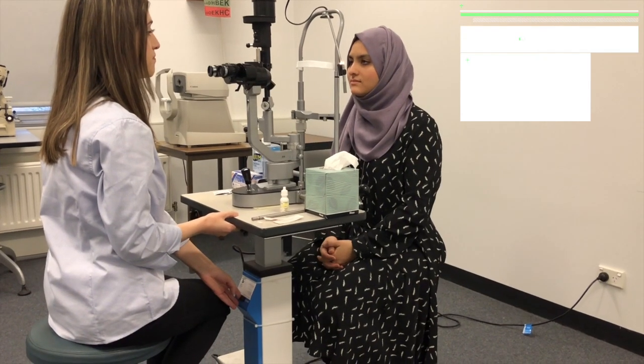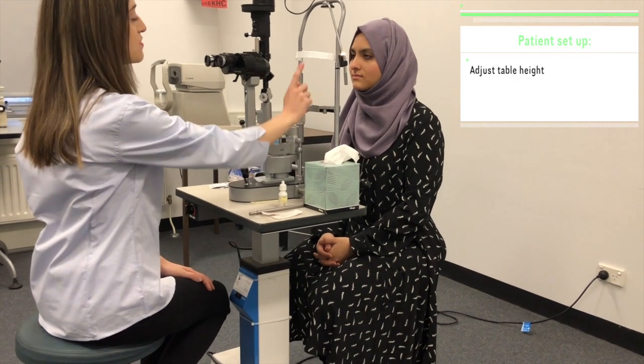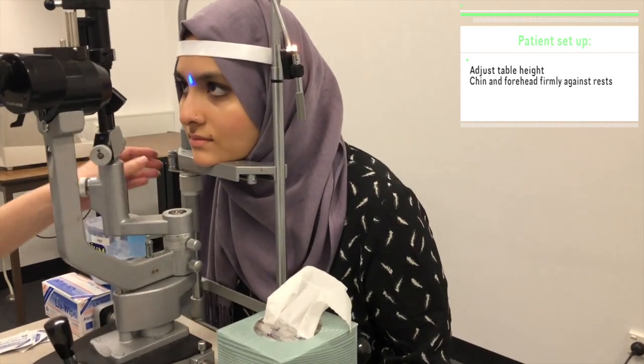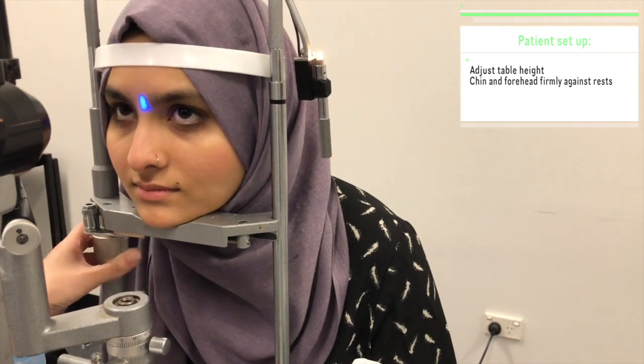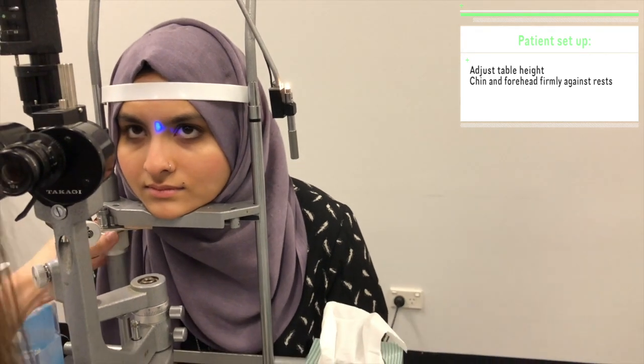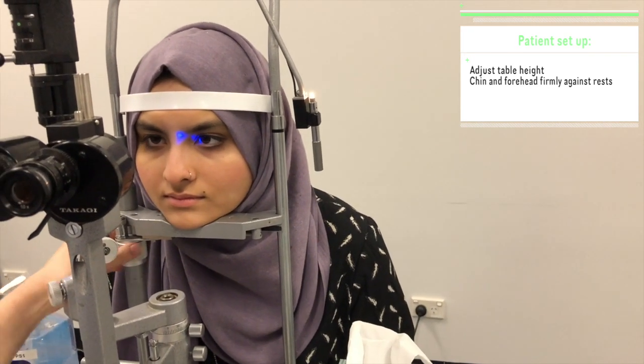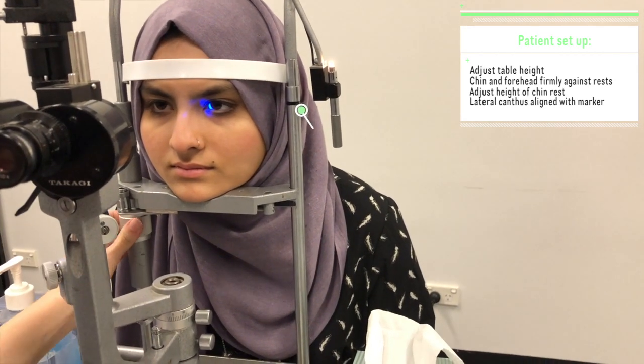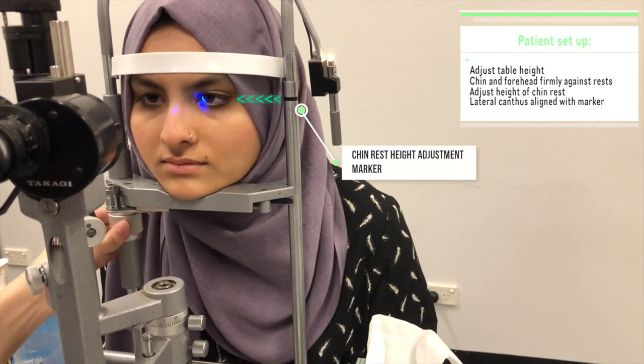The examiner adjusts the table height for the patient's comfort, and the patient is then asked to place their chin upon the chin rest and their forehead firmly against the forehead rest. The height of the chin rest is adjusted so that the lateral canthus of the eye being examined is aligned with the marker on the slit lamp.